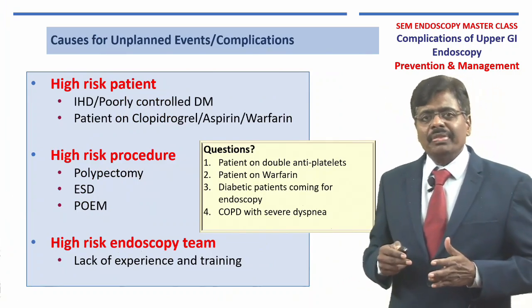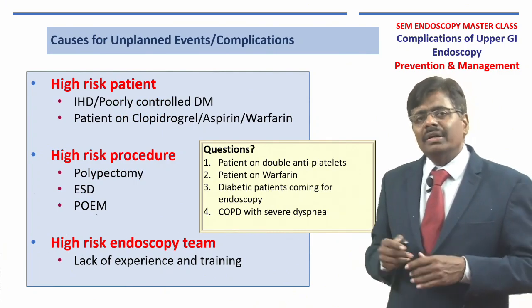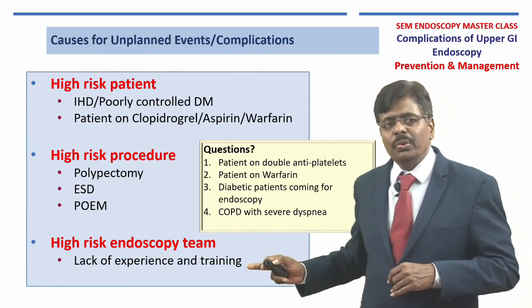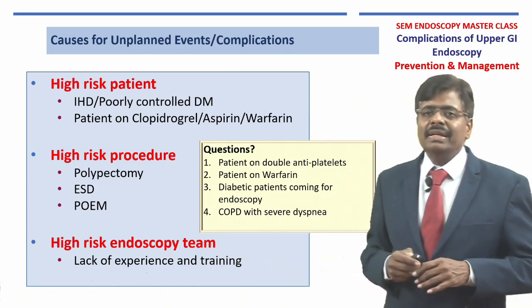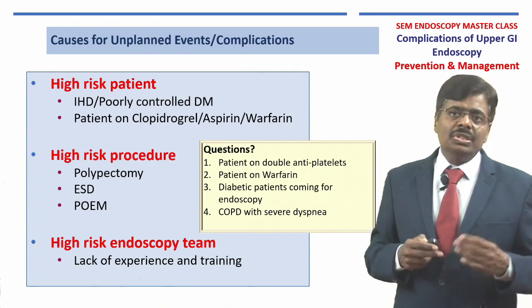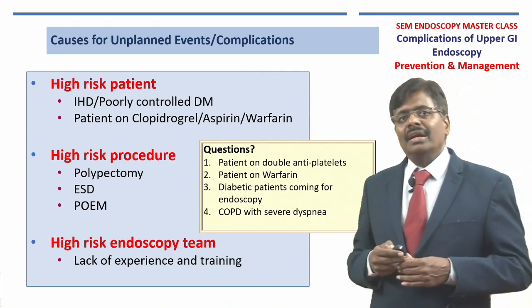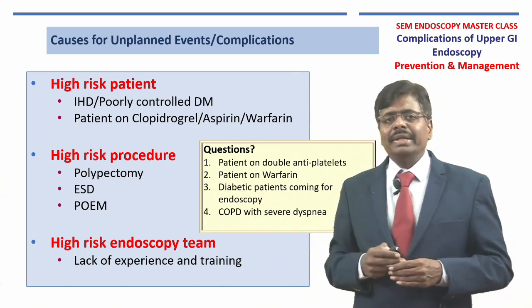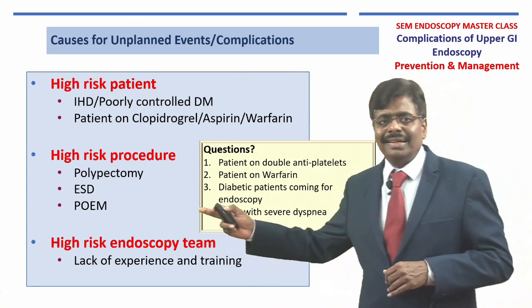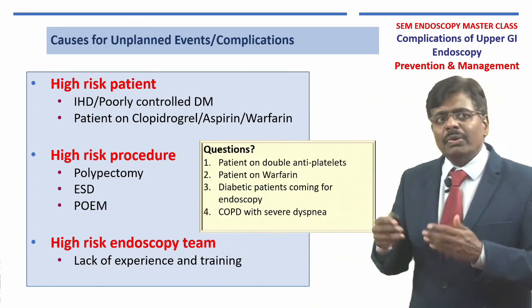Before we go in, we need to divide into 3 categories why the complications happen. It is because of you, the team, not being very well experienced. That is why I am having this class, to improve your knowledge on the potential reasons for complications. Second, in the beginning you do not take the high risk procedures, and next, of course, try to optimize your high risk patients.